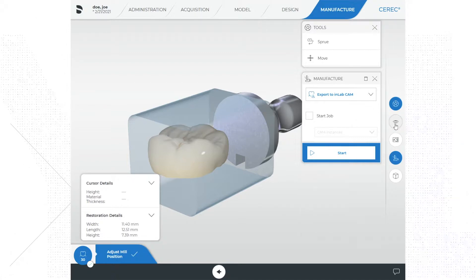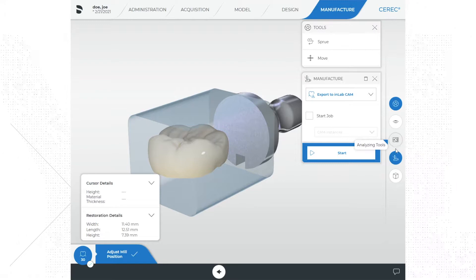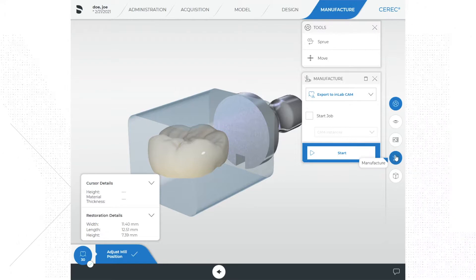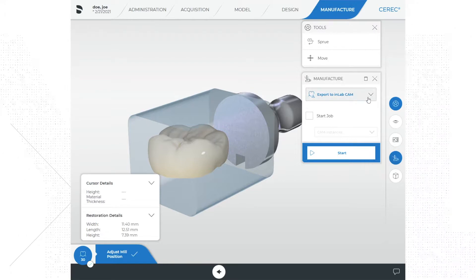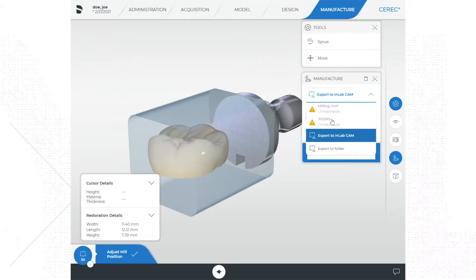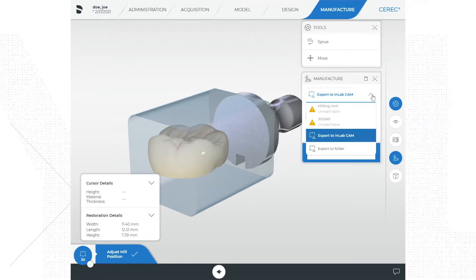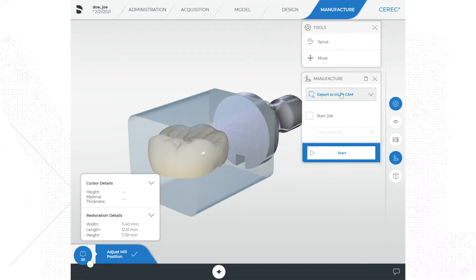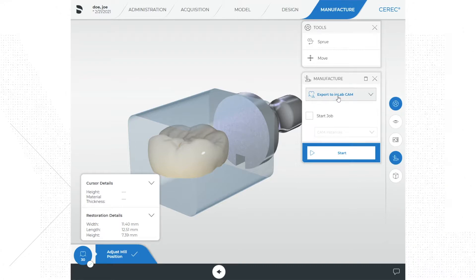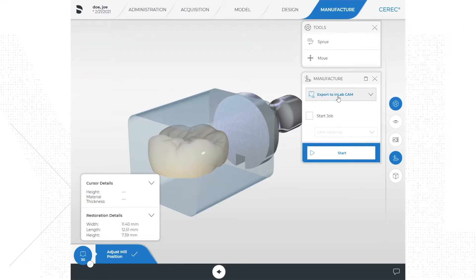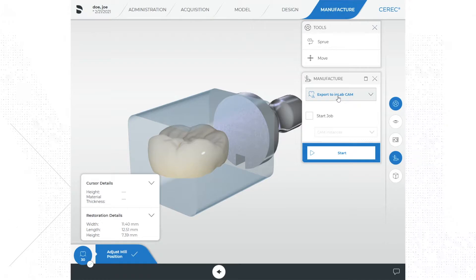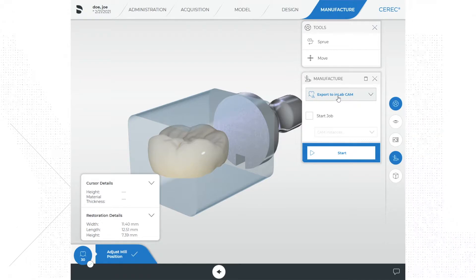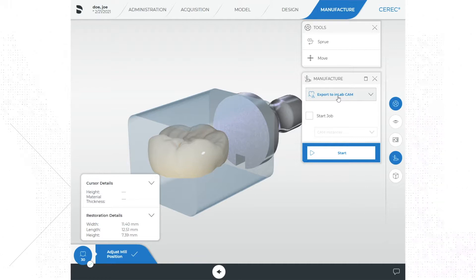You will also see a menu called manufacturer. Within this menu you will see an area to select the mill at the top or choose other options by selecting the drop down menu. We can also export the case as an STL file using the export to folder option. You would use the export option if you were going to send the case to a lab to be milled. We're not going to be doing that in this video, so let's select the mill you will be using.